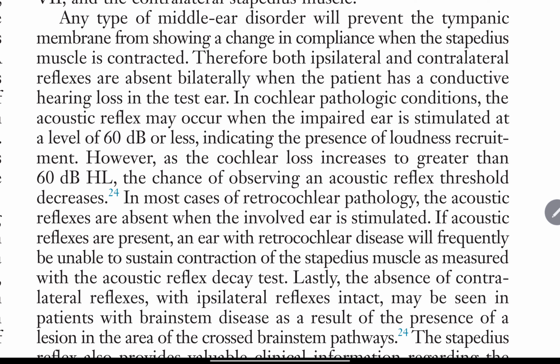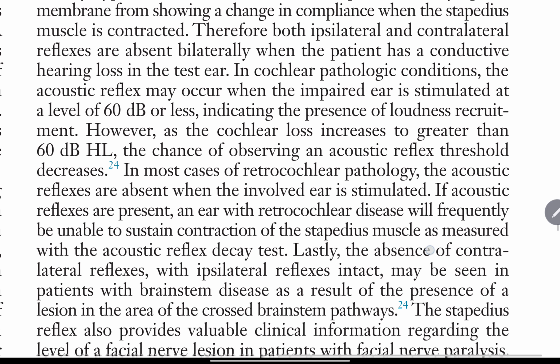Lastly, the absence of contralateral reflexes with ipsilateral reflexes intact may be seen in patients with brainstem disease as a result of the presence of a lesion in the area of the crossing brainstem pathways.